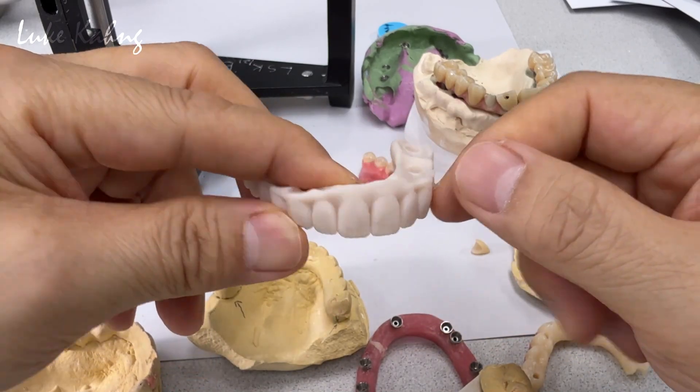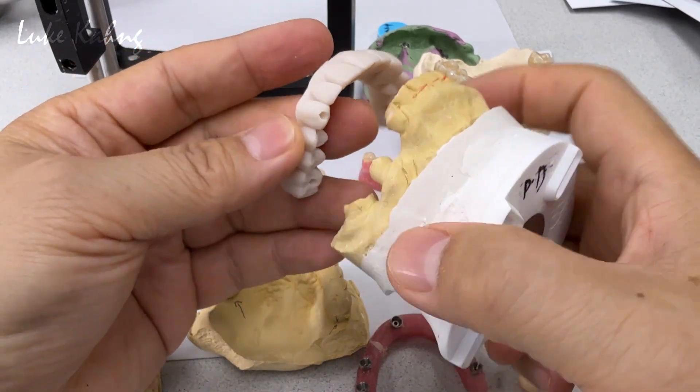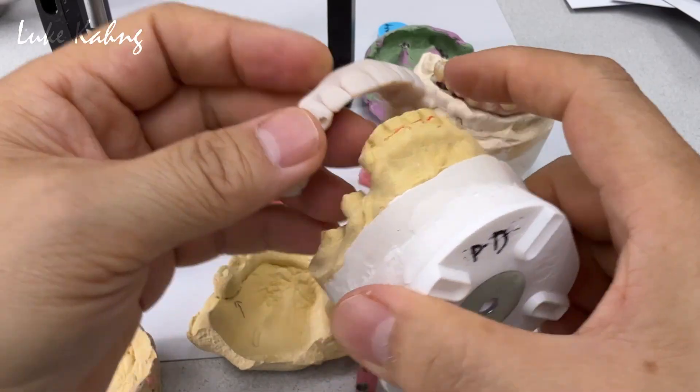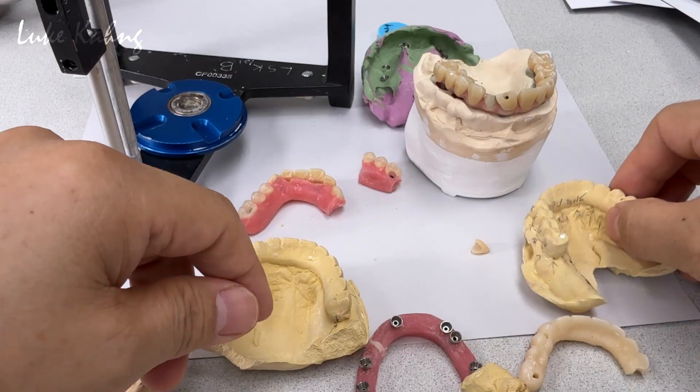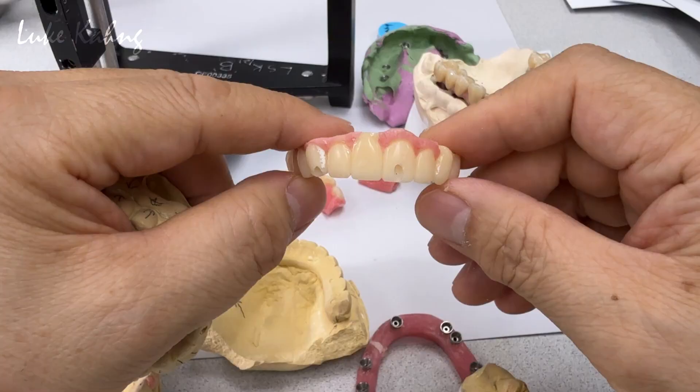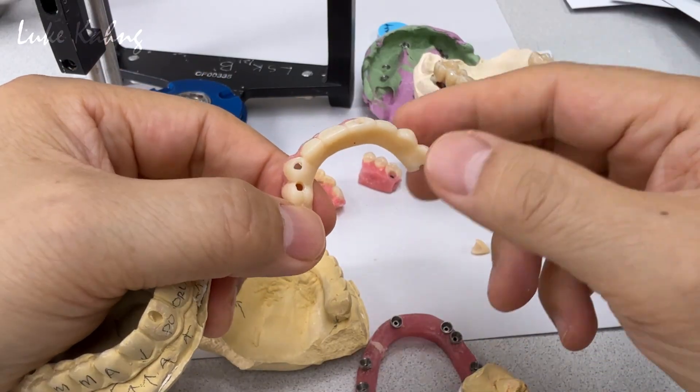This is a print model, and they tried it in — still overjet. Finally, we fabricated it with PMMA and tried to bring it in more.